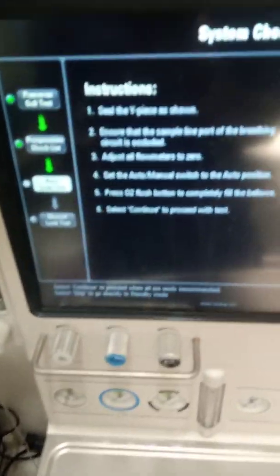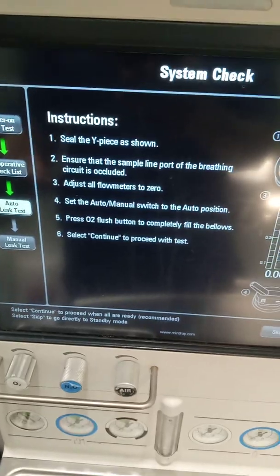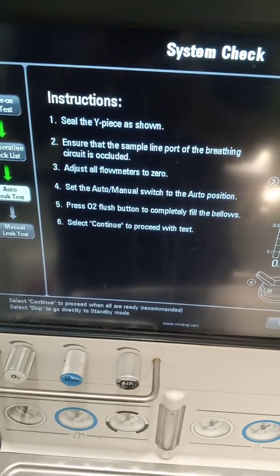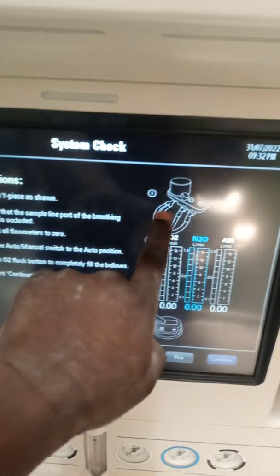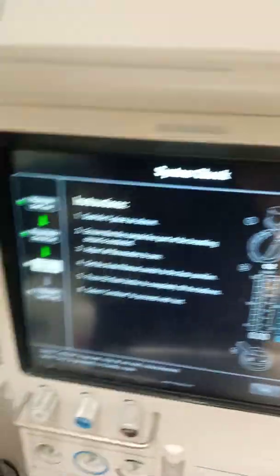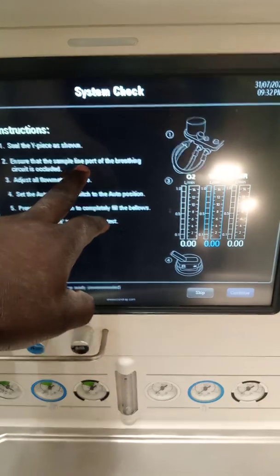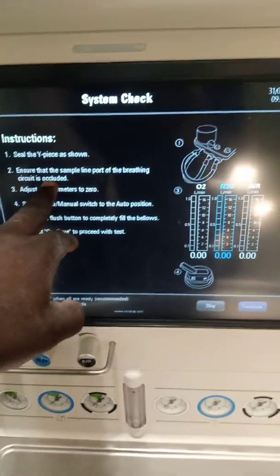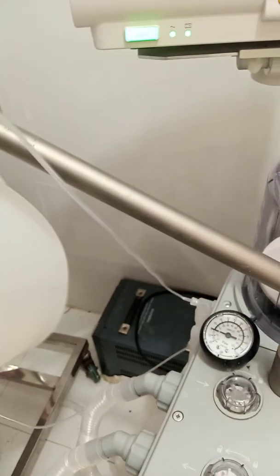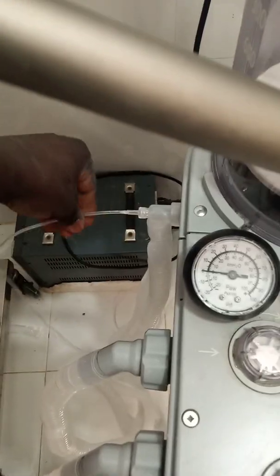These are the calibration instructions. The first instruction is to seal the Y-piece as shown — it is showing us where the Y-piece is, and we have occluded it. Second instruction: ensure that the sample line port of the breathing circuit is occluded — as I indicated earlier, this is the sample line port, and it is also occluded.